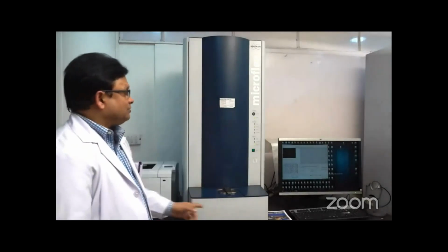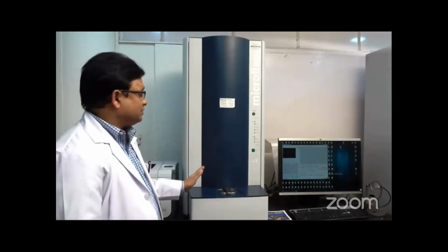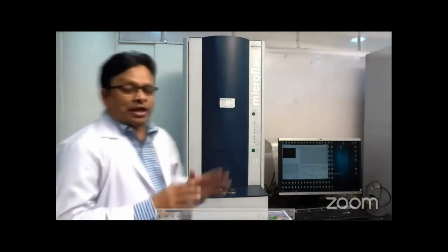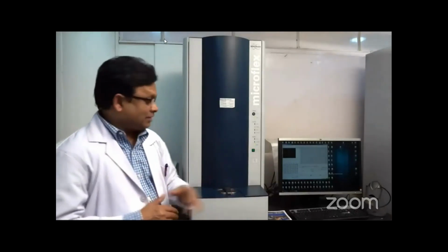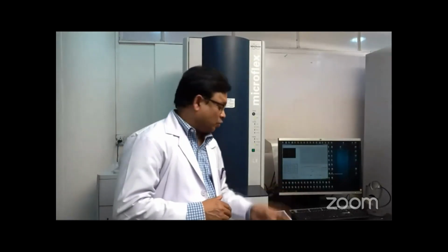In this technique, basically the ribosomal protein spectrum is used to identify the organisms. This is the MALDI machine. It is called the Biotyper. Bruker Germany markets this machine. With this machine I am going to demonstrate how we can identify clinically important fungi. You know that fungi can exist as yeast, mold, or both yeast and mold in the case of dimorphic fungi. But we are going to demonstrate only the identification of yeasts and molds.